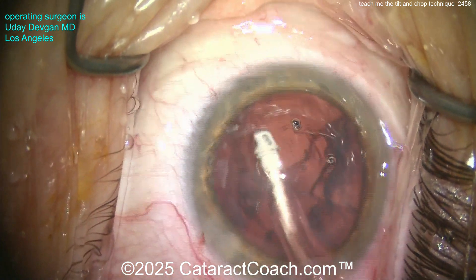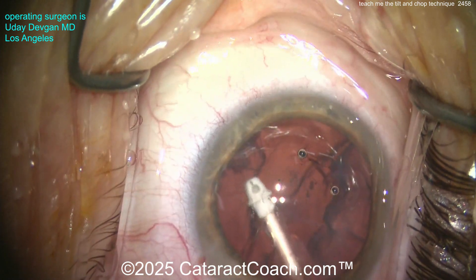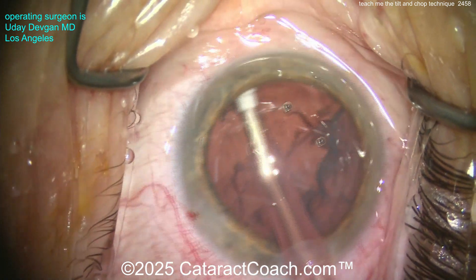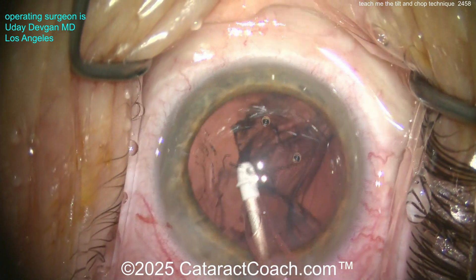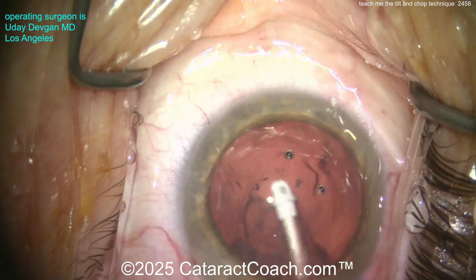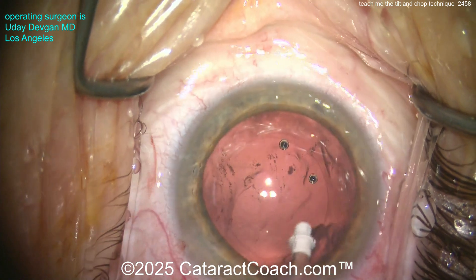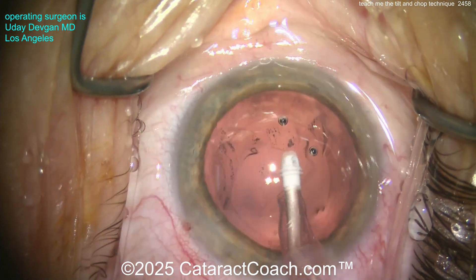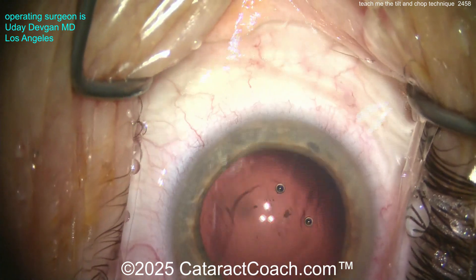Now cortex removal — I'm using a coaxial cortex setup here, nice and easy. I've already called for the IOL and the technicians are loading that up. In this case I think we're going to use a single-piece acrylic preloaded to make life even easier. Cleaning up the capsular bag — want to be gentle as we grab the cortex. Always look at the rhexis margin, make sure it's not moving.